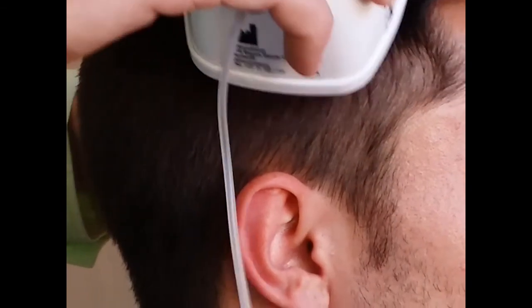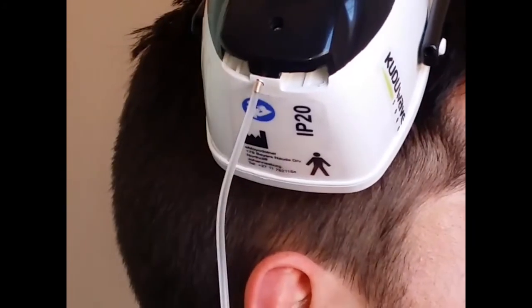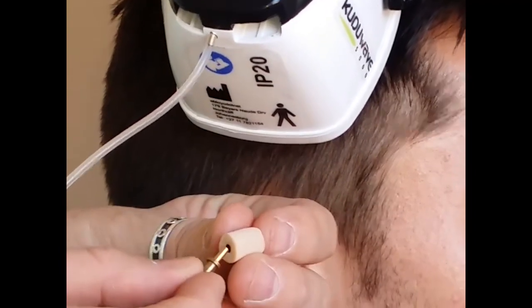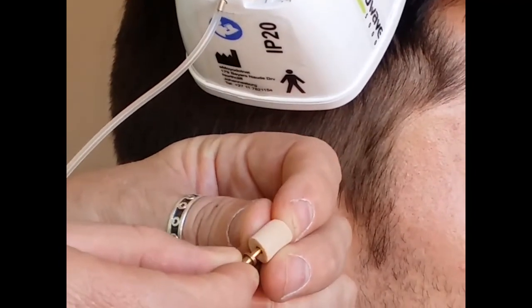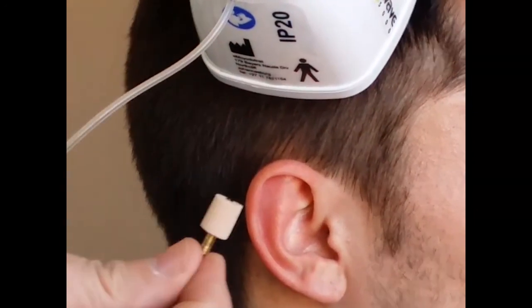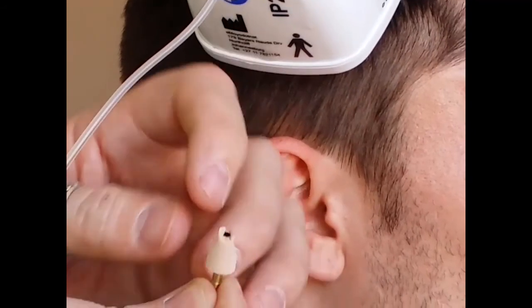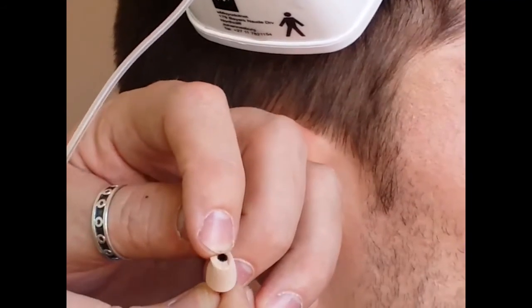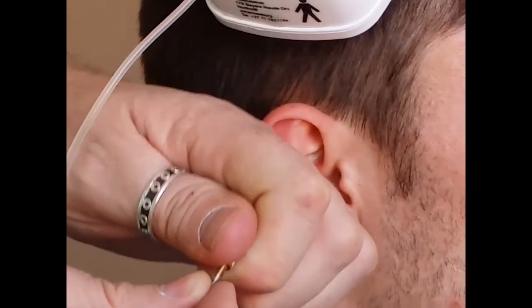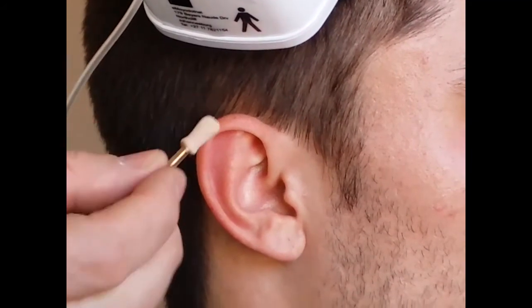Cup and put it in a sweet spot on the head. It will stay there. Next, I will take a foam ear tip and push it into this tube all the way. I will pinch the ear tip right at the tip so that this black tube won't scratch the inner ear. Then I will roll the ear tip to a small ear tip.